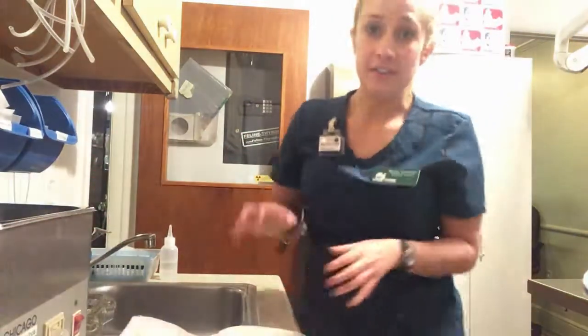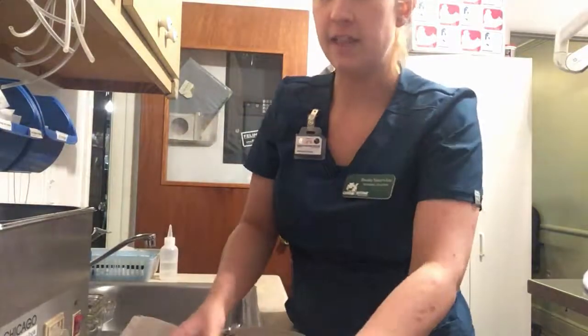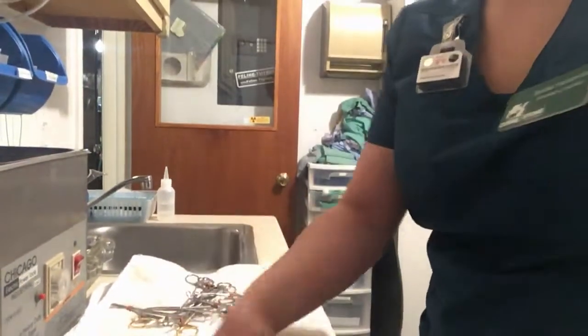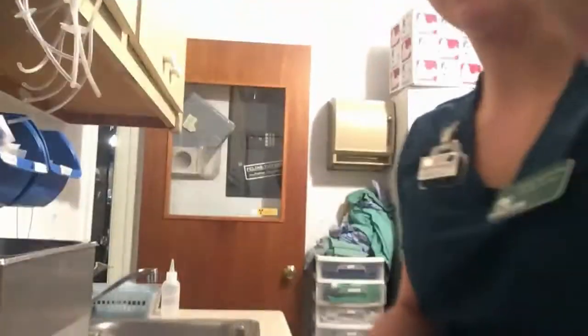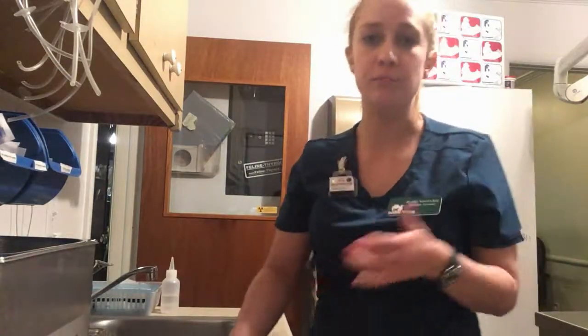Okay, now that that's done, I'm going to go ahead and take out my instruments and lay them out on a towel so that they can properly dry. You don't want your instruments wet going into the sterilizer because they're going to stay wet. And now they're completely clean and ready to be wrapped for sterilization.